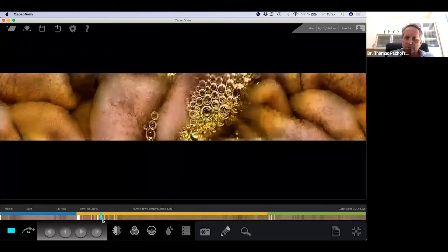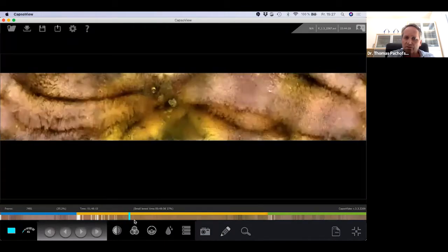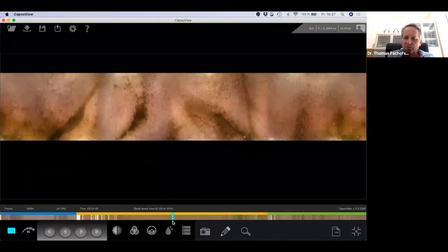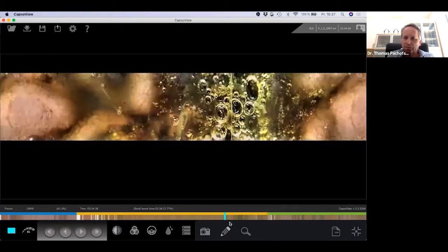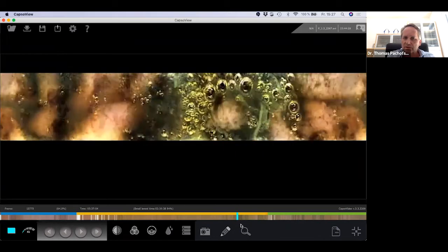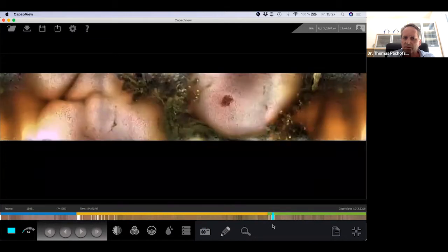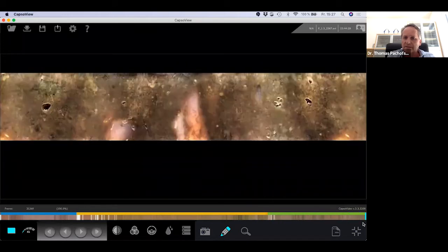If you look at the screen, you will see, yes, there is some angiodysplasia, so we can find some pathologies here. But this first screening is only to look if there is a really severe pathology I can find. Here is now some stool. You can also see some blood, not so much. And here now we are in the cecum, and here you can also see we have an angiodysplasia in this area in the cecum. So that's how I'm starting.